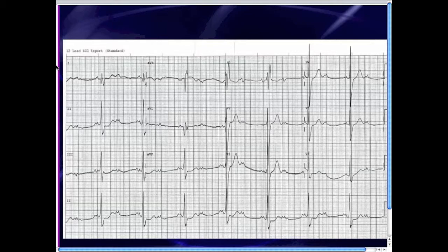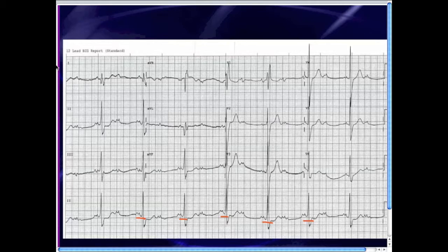We're not worried about first degree AV block. The real question is whether this is second degree AV block type 1 or type 2 — also known as Mobitz 1 or Mobitz 2 — or is this third degree AV block? If this were third degree AV block, you would expect the PR segments to be changing fairly randomly everywhere. You clearly see the PR segments are not changing randomly, so we can eliminate third degree AV block. With Mobitz 1, the PR segments gradually increase then you get a drop; with Mobitz 2, the PR segments stay the same with a drop.